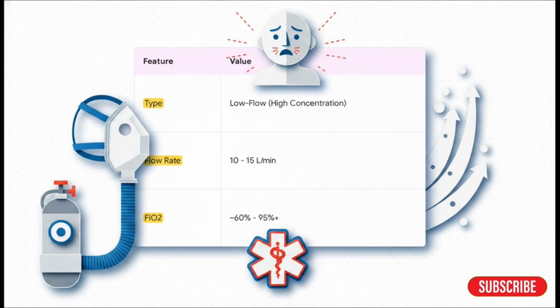All right, time to bring out the big guns. When you see a non-rebreather mask, or an NRB, your brain should instantly scream critically ill. This is our go-to for someone in serious respiratory distress. We're cranking that flow rate way up to 10 to 15 liters per minute.